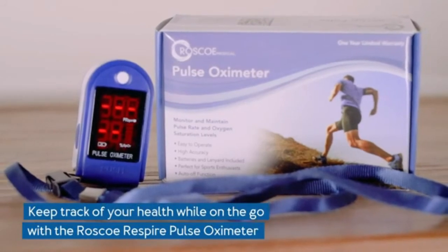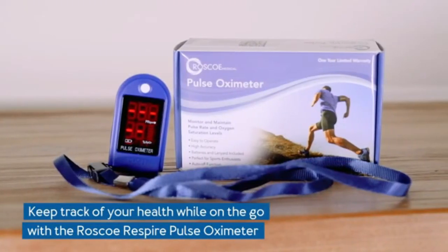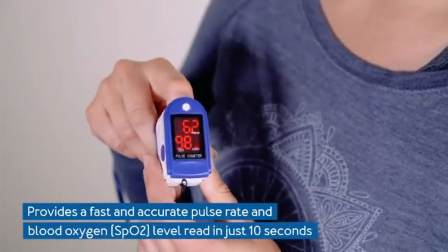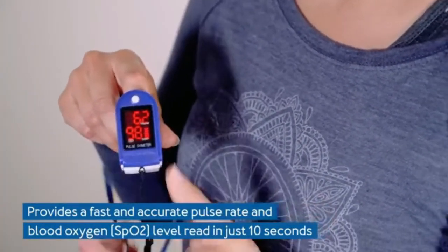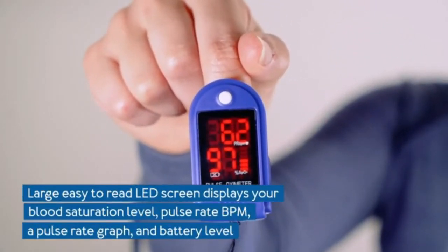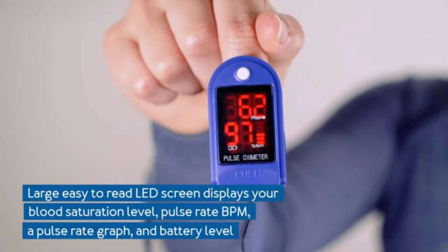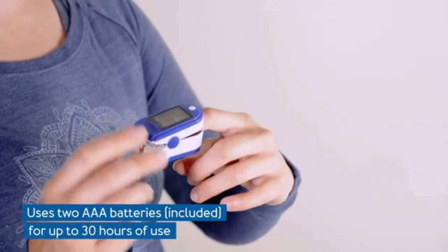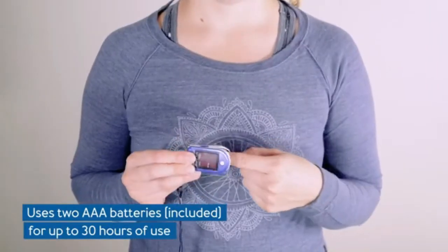Pulse oximeter oxygen saturation monitor — O2 monitor for pediatric and adult sports and aviation use. 10-second pulse and oxygen meter check. The Rosco Medical Pulse Oximeter Finger Clip is a compact heart rate monitor and oxygen monitor that checks pulse rate and blood oxygen saturation levels (SP02) quickly and accurately.